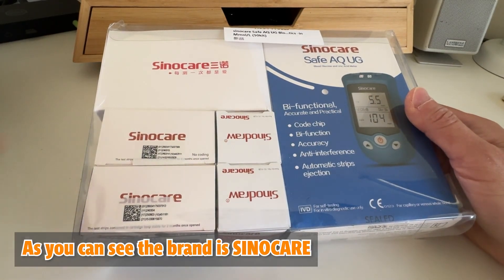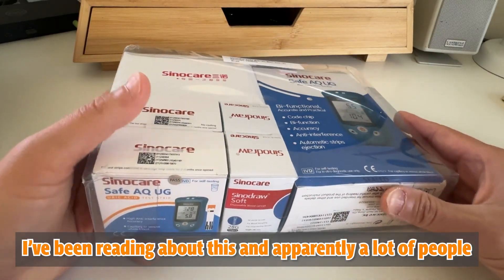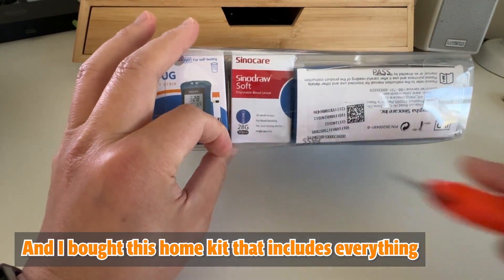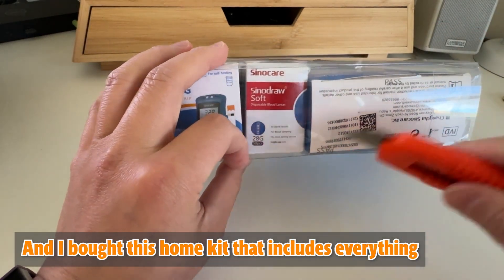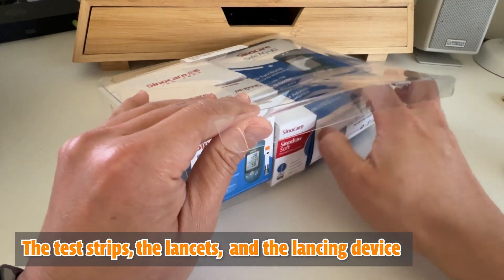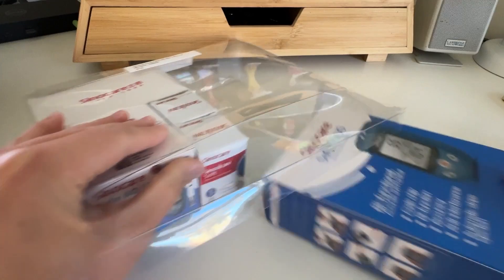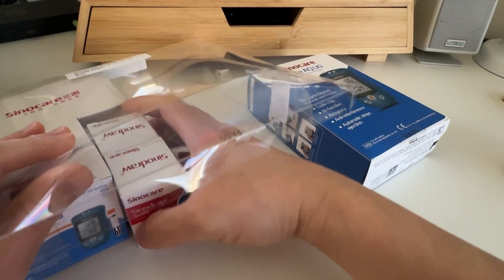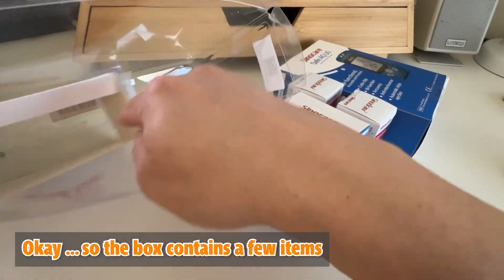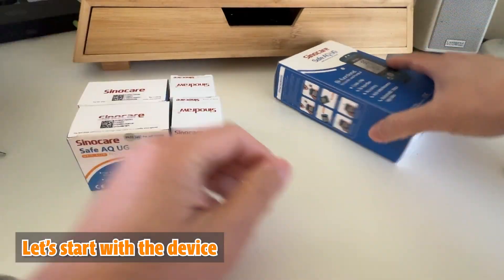As you can see, the brand is Sinocare. I've been reading about this and apparently a lot of people are happy with this product. I bought this home kit that includes everything — the test strips, the lancet, and the lancing device. So the box contains a few items, let's start.